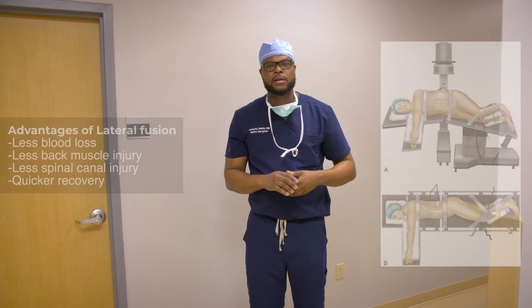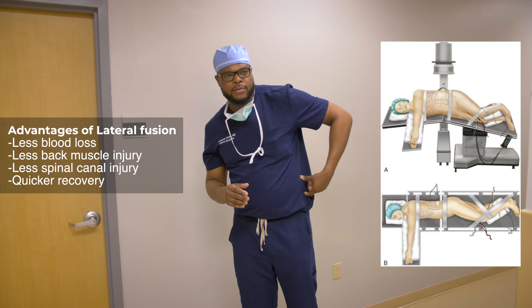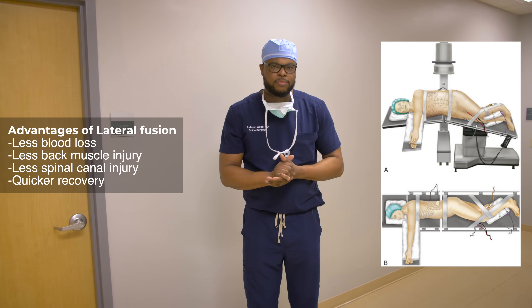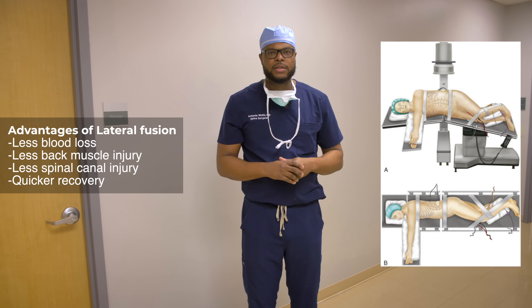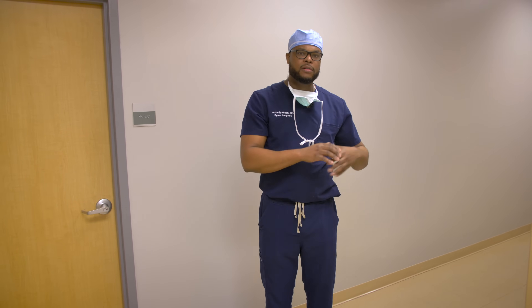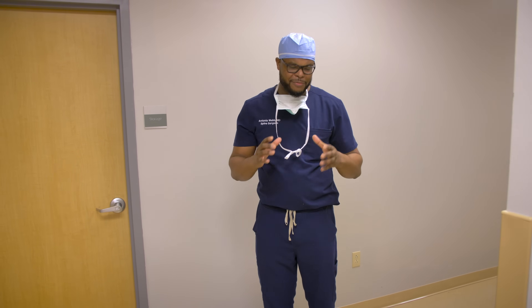This is a procedure for patients who have instability of their spine, spinal stenosis, and arthritis. I make a small incision on the lateral side of their flank. The patient lies on their side and I'm able to place a large cage into the spine to decompress and fuse it. This takes the pressure off the nerves and spinal canal, then the patient is turned over to place percutaneous screws.